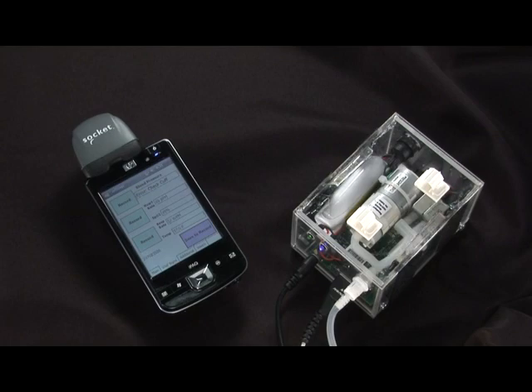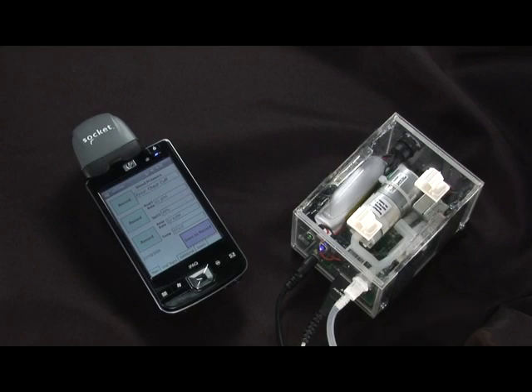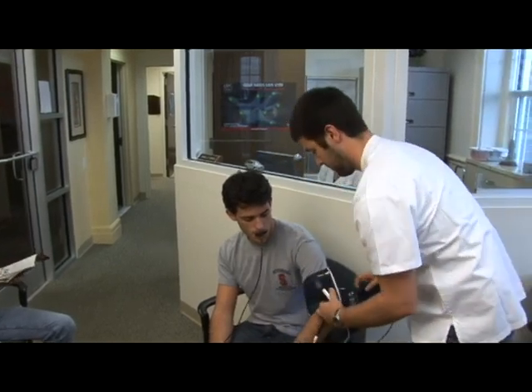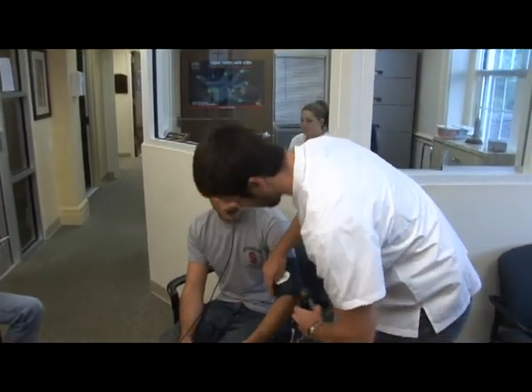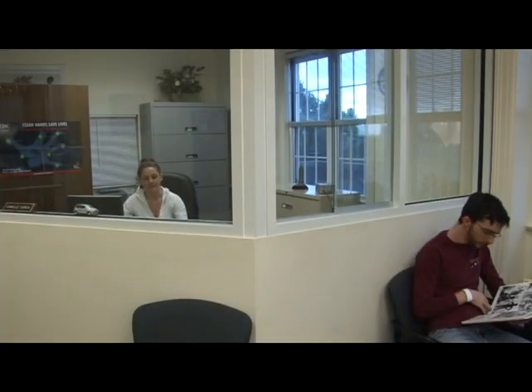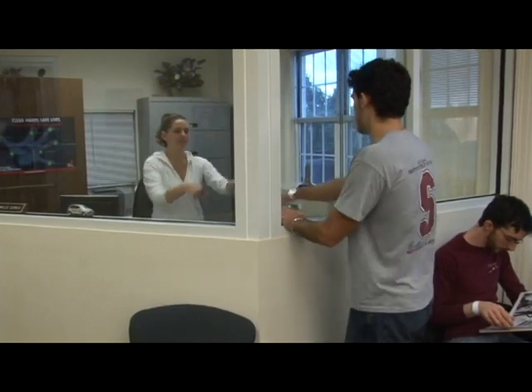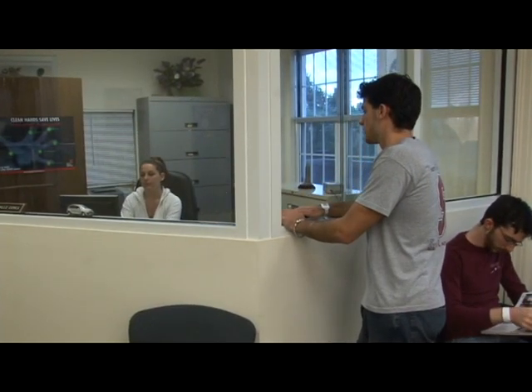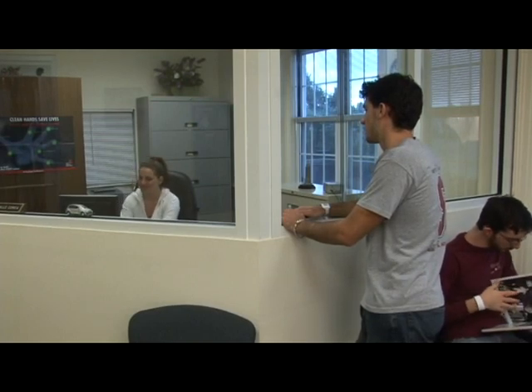The separation of device control and display from the acquisition device makes it much more mobile and versatile. Patient vitals can also be reassessed quickly and easily while they are waiting for treatment, allowing for changes in vital signs to be tracked accurately over time. Patient management software can be used to monitor patient status and ensure they receive treatment or are re-evaluated at the appropriate time.